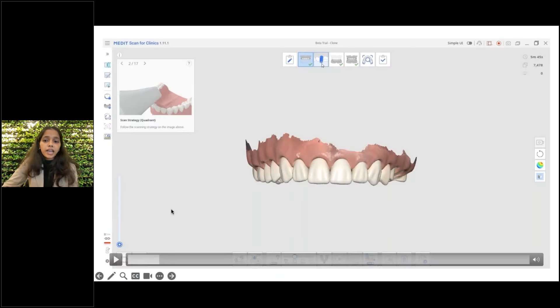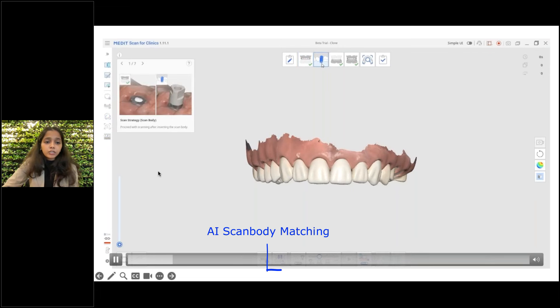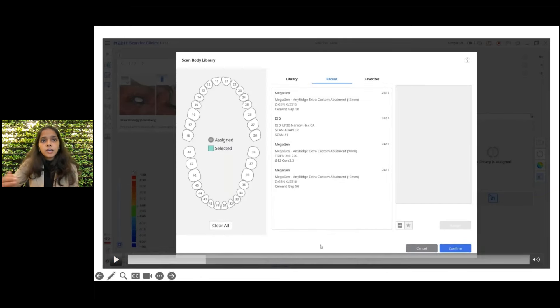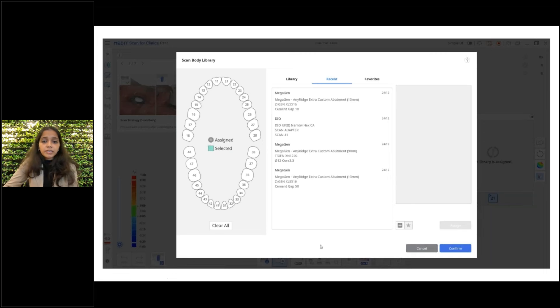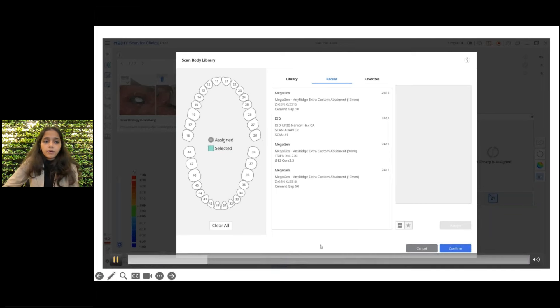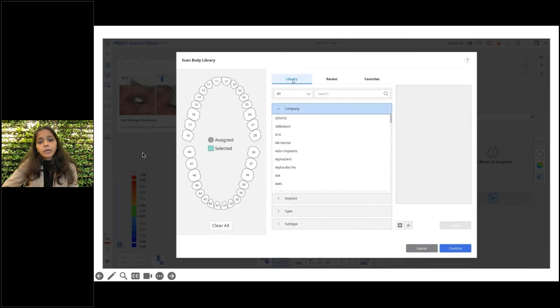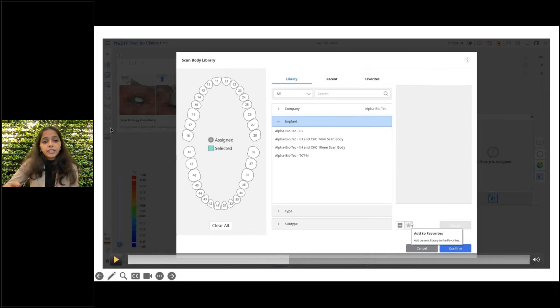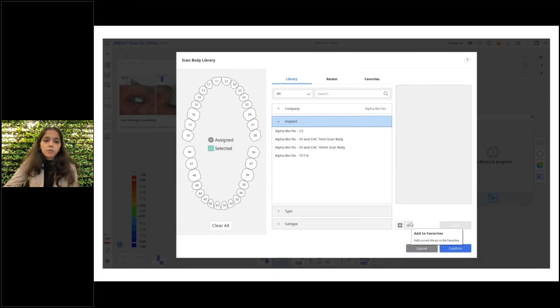Here I have already added a scan body stage from the stage management. In the scan body stage, click on the AI Scan Body Matching feature. Once you click it, go to the scan body library tab and search for the scan body you require. For instance, I am trying to find the Alpha Biotech CHC scan body, which is currently not available in my Medit Link software. Fortunately, I do have the CAD file of this scan body stored on my local PC.